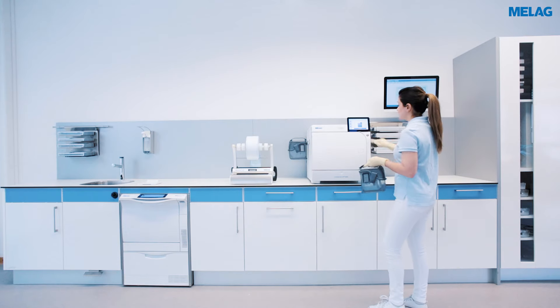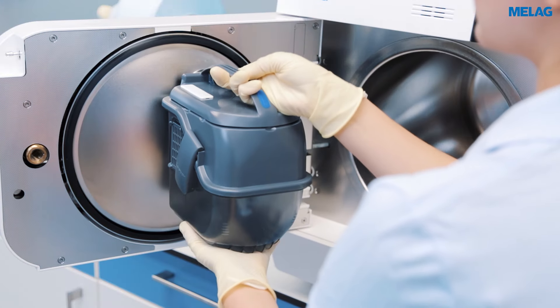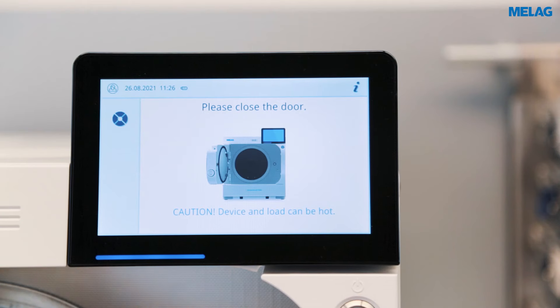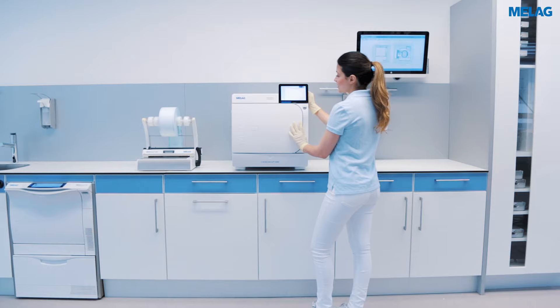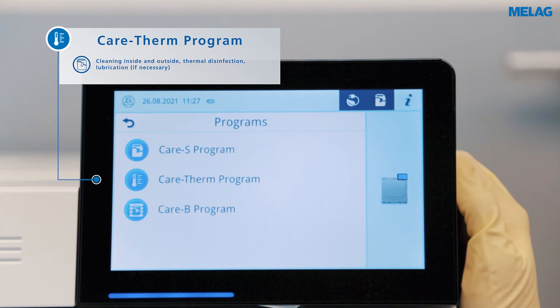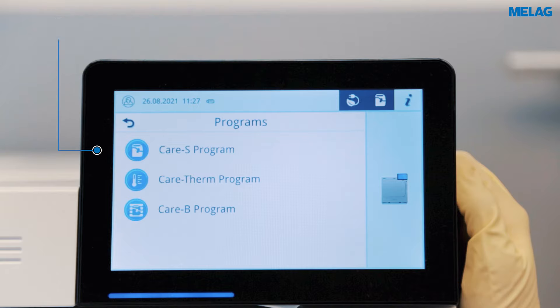Careclave automatically adjusts the program selection to your load. After inserting a care box, the menu changes to Careclave mode. You can now select the CareTherm program and the CareS program for cleaning, decontamination and oil care of up to eight hollow instruments in the care box.